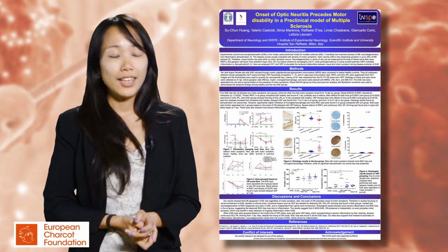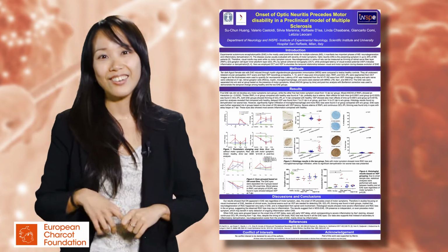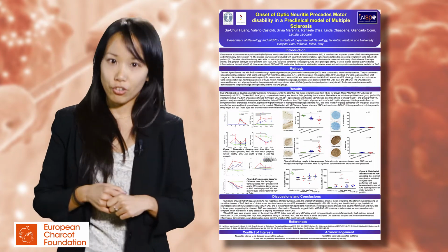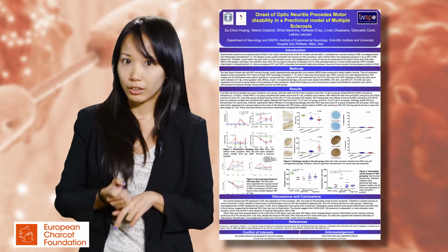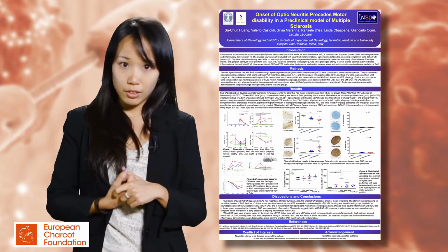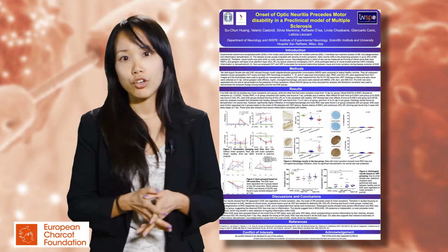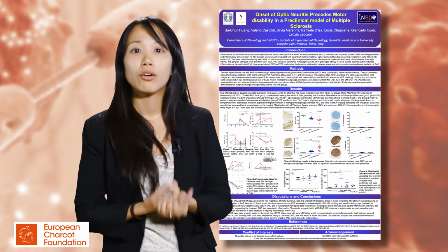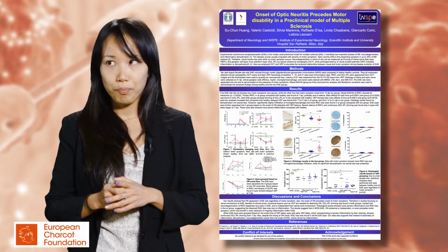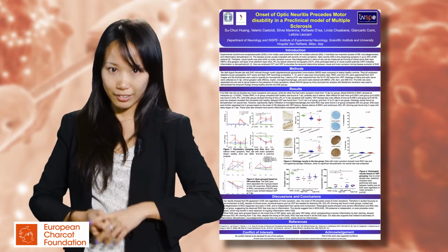Then we move on to the histology. If you look at this part of my poster, you will see the histology. At this early stage, we find no demyelination and no axonal loss in the optic nerve. But interestingly, we find a very severe inflammation. We used IBA1 for the infiltration of what could be microglia or macrophages. And we also see a very strong reduction of ganglion cell count.